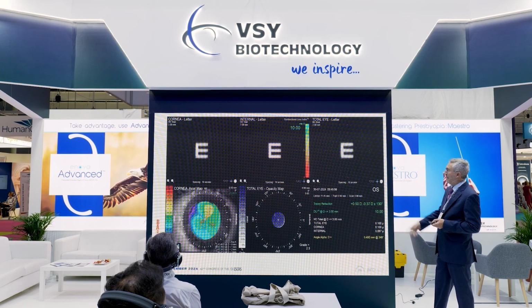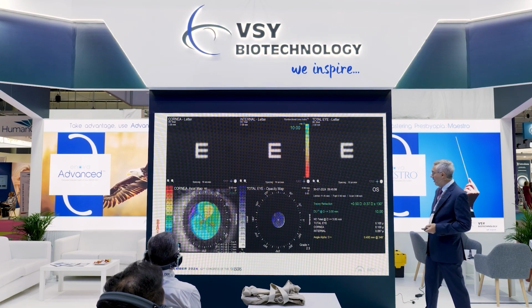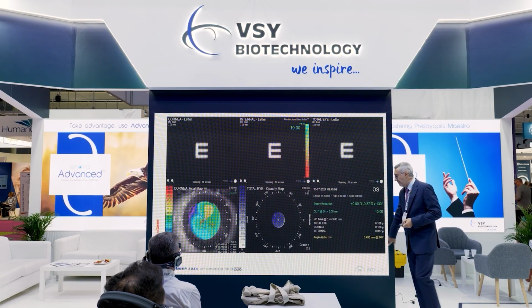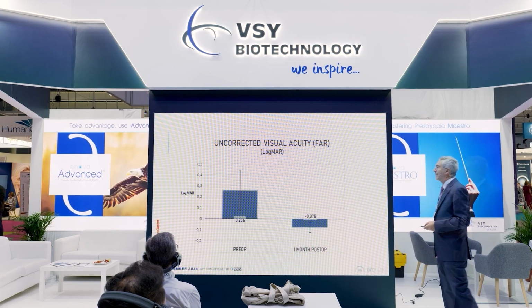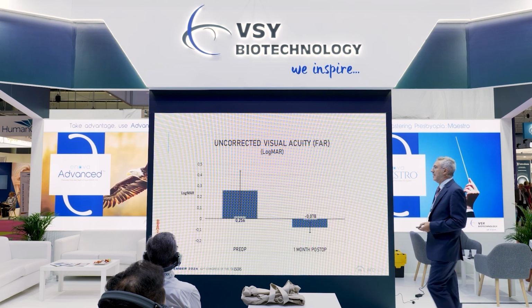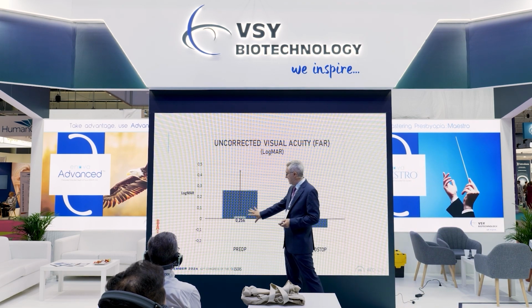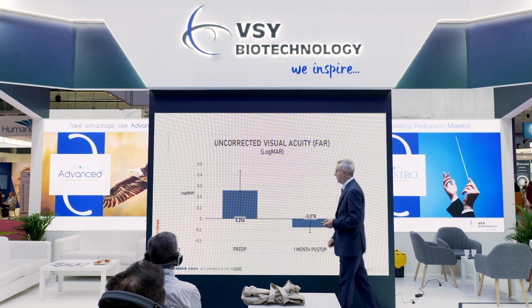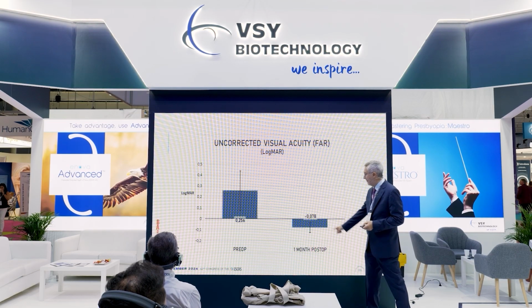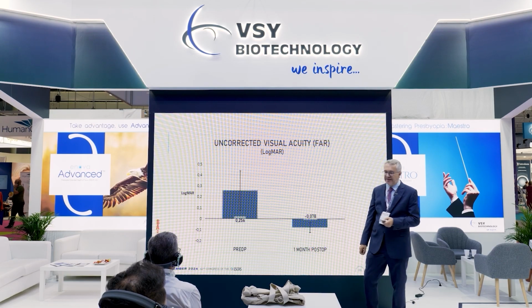Here we are showing some of the early results in the postoperative period, always having very good vision, but quite often suboptimal angles. This is the mean uncorrected visual acuity in the far analysis, going from a preoperative of 0.256 down to minus 0.078.